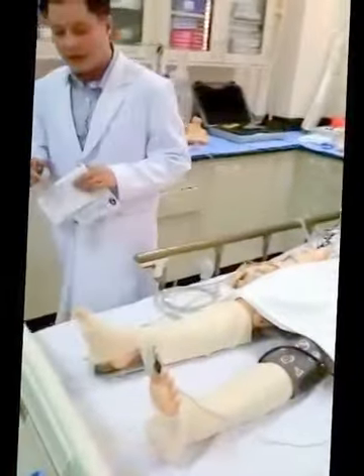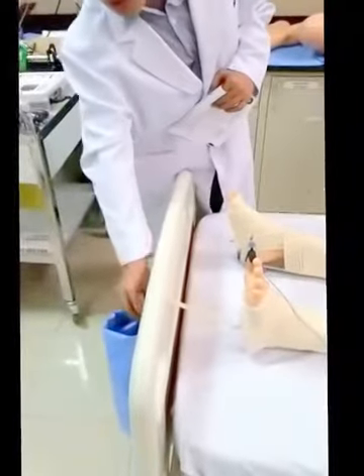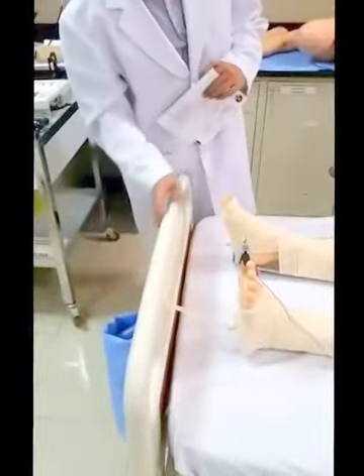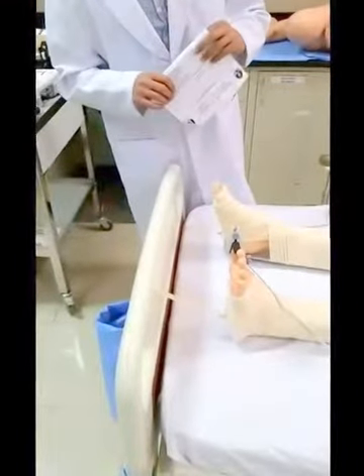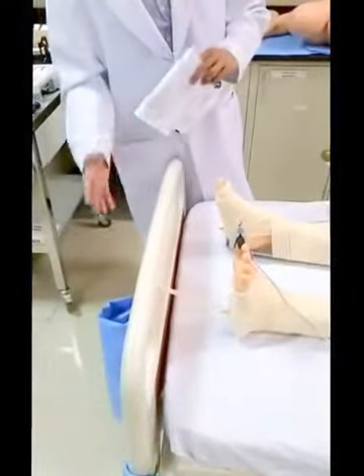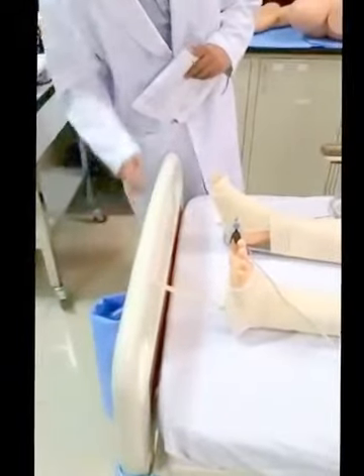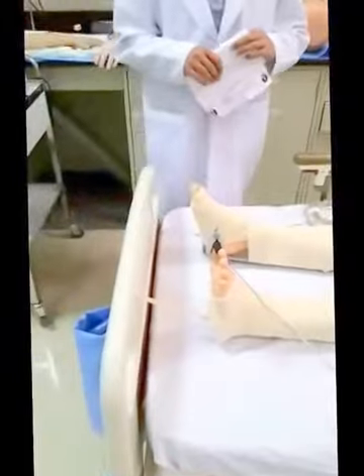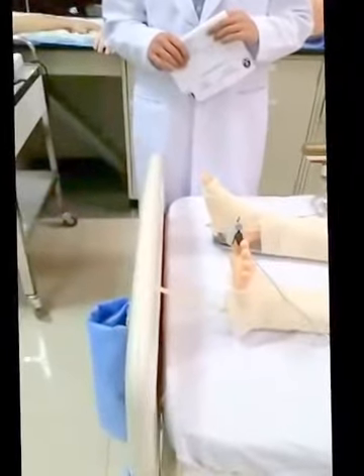Now, we notice that for the patient with traction, we should make sure that the weight should be hanging freely. Okay, so generally, we should make sure that the weight should not touch the frame. It should not also touch the floor. So this is basically the principle that we should be watching.